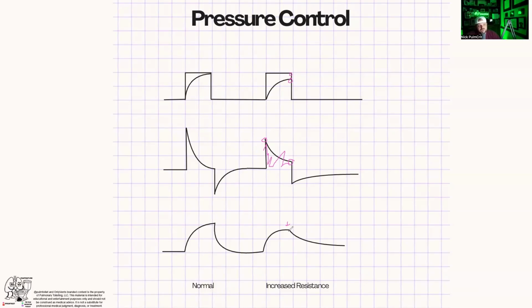But in expiration, what you'll see is, right, our longer time constant. So that wasn't longer, that was shorter. Let me erase that because it's super confusing. All right, perfect. So this black line is a longer time constant than this black line, right? So if I superimpose this over here, so let's say this was normal, at every time point, there's more volume because there's less flow coming out because of some time constant issue, either resistance or compliance.